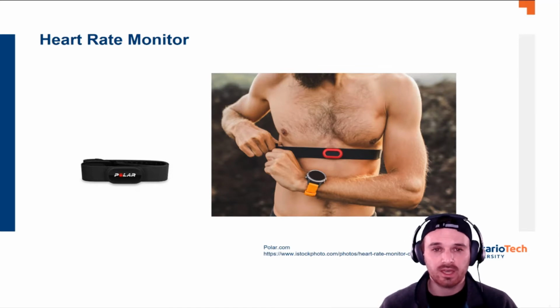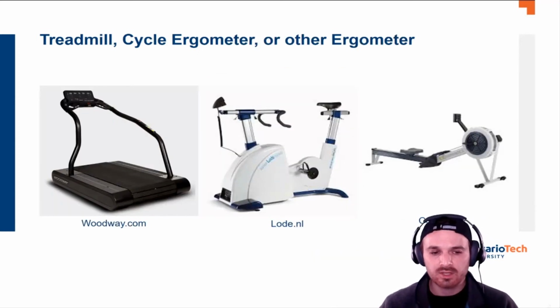You can definitely do palpated heart rate, and you'll see that we're going to do that in this video. Because this is staged, you don't need data points at every single time point, but heart rate monitors are so cheap nowadays that it really is super nice to have one as a backup and have that continuous data. Then you can just write it down at the end of each stage, and you're not trying to multitask, doing a whole bunch of things and potentially missing something, especially if you're just starting out running these tests.